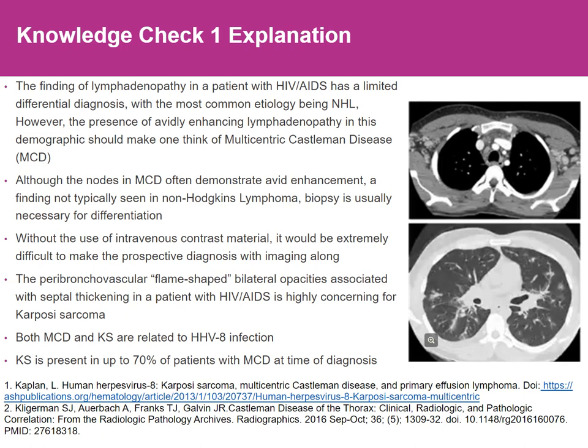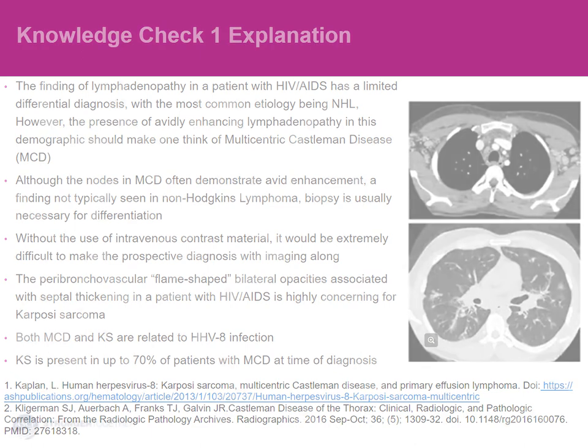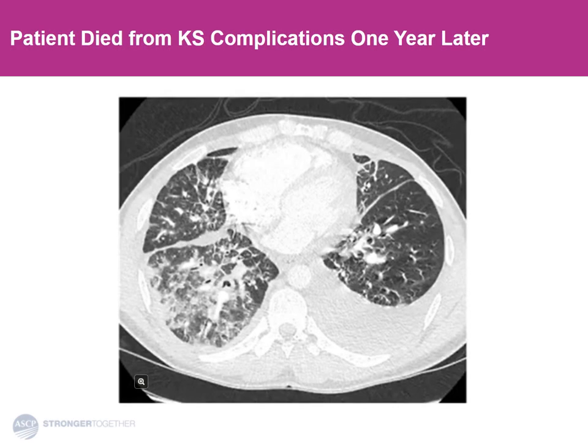One paper found that up to 70% of patients with multicentric Castleman disease will have Kaposi's sarcoma in nodes or elsewhere at the time of diagnosis. This is what happened about a year later — more fulminant Kaposi's. There's extensive abnormality here: increased thickening of the peribronchovascular interstitium, increasing ground glass, worsening septal thickening, and the patient passed away.